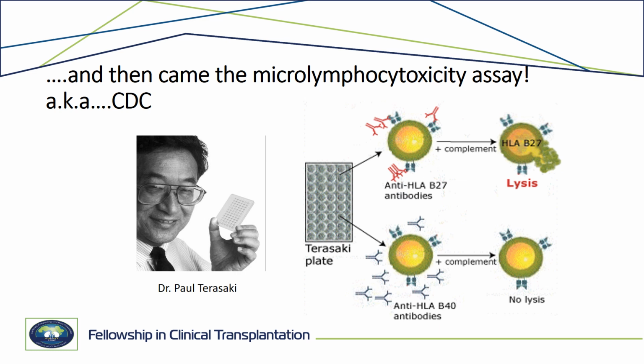Paul Terasaki was a pioneer Japanese-American scientist who developed the first clinically approved test for HLA typing. This is known as the complement-dependent cytotoxicity assay. He named this plate the Terasaki plate. This was a plate which has 72 wells, and each well has a different anti-sera in it.